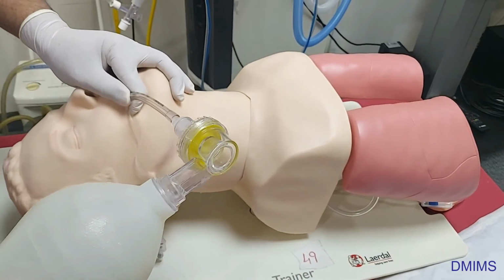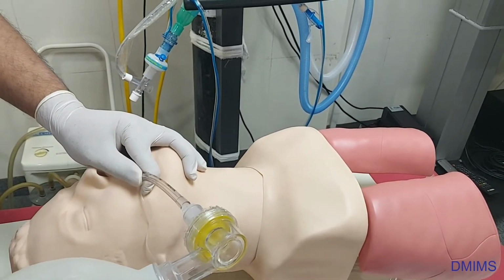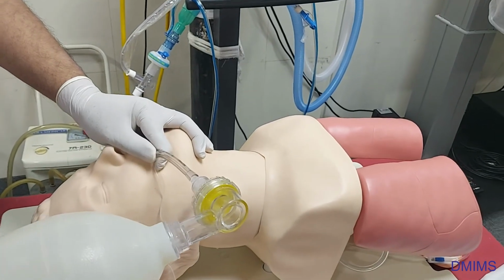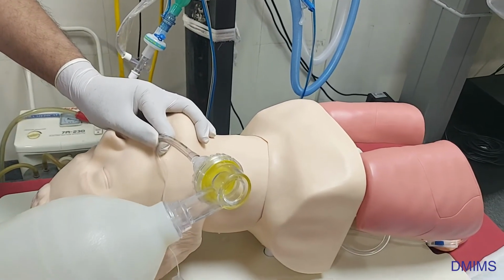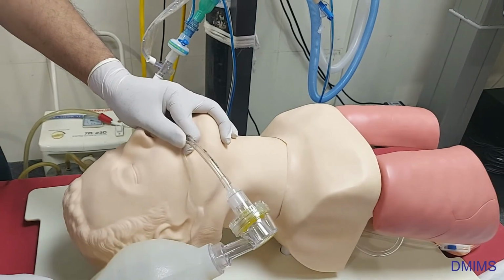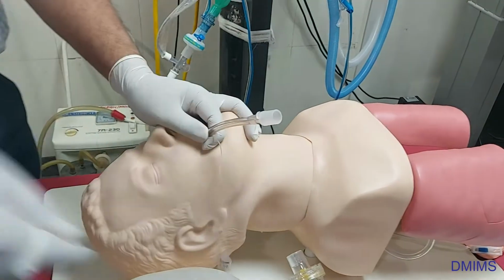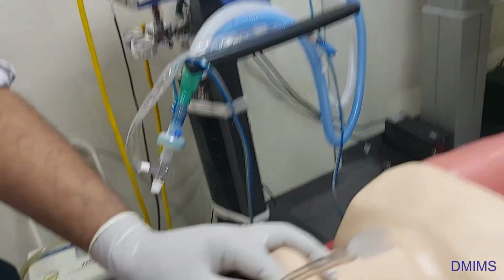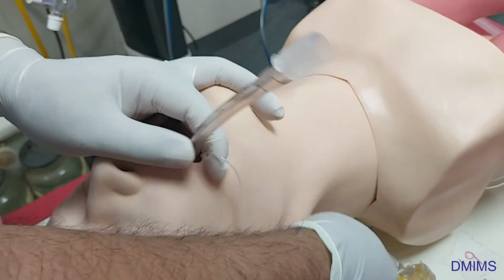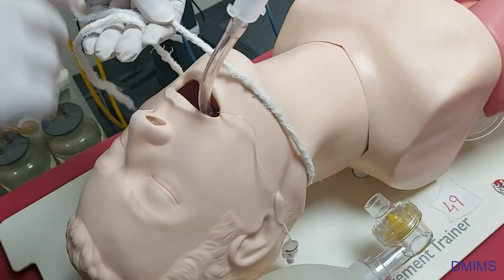As you can see, both lungs, which are exposed, move when I am doing the ventilation. Otherwise, in a live patient, you have to auscultate on both sides and see that the air entry is proper on both sides. Then, as I am giving ventilation with 100% oxygen, I can disconnect it. If I have someone to tie, I will get help. You need one assistant for tying and helping you hold the tube.